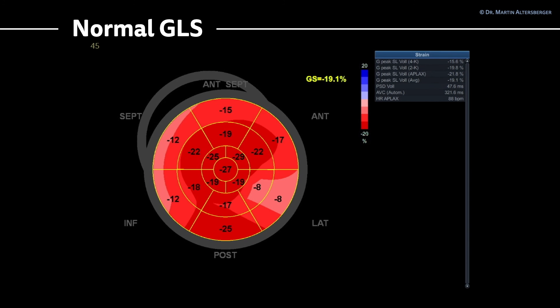Continuing with the bullseye display, we see an overall normal global longitudinal strain. Recall that the normal value should be around minus 18 to minus 20. In this case it is minus 19.1%, confirming a normal global longitudinal strain of the left ventricle. Looking at the bullseye display more carefully, there is some basal reduction in strain in the basal segments, which is an important marker to follow up on. Overall, I would rely on the global longitudinal strain of minus 19%, which is normal.